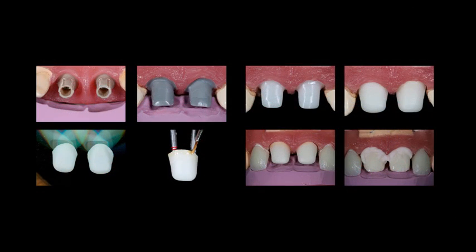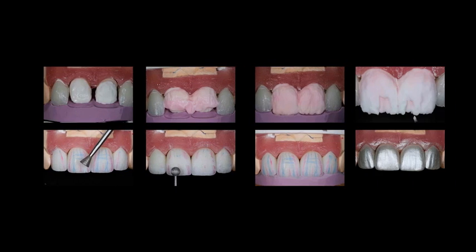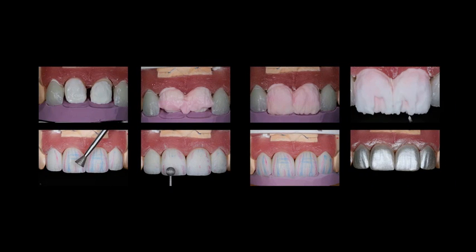So then we send this to the ceramist and he builds the case, and he uses a little tissue mold which represents the tissue from the patient's mouth, which he uses our impression to make. So this is very accurate at this point. And this case is done with zirconia abutments and Lava crowns and porcelain veneers, layered porcelain veneers on the lateral incisor. So you can see all the layering that goes into the case.